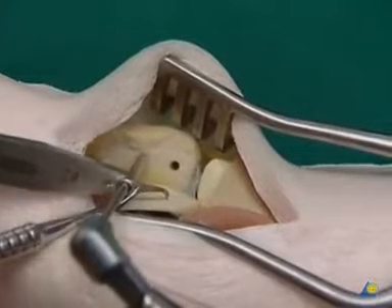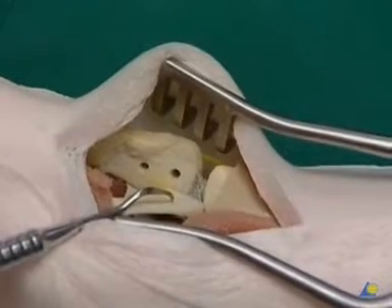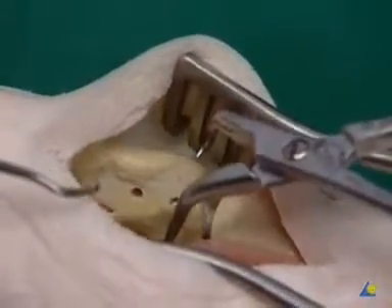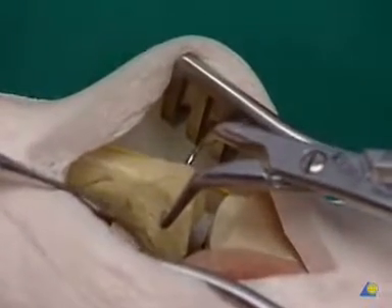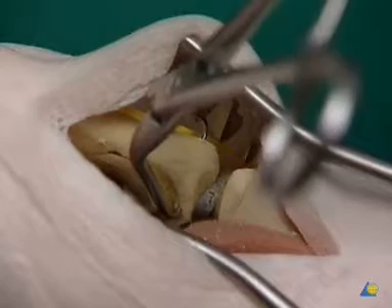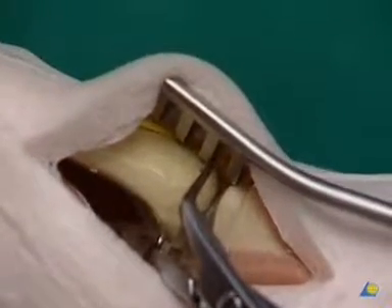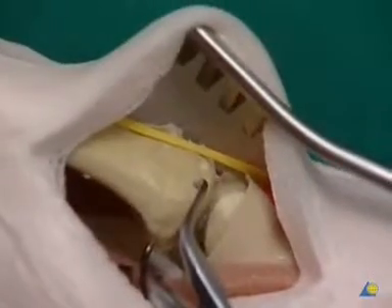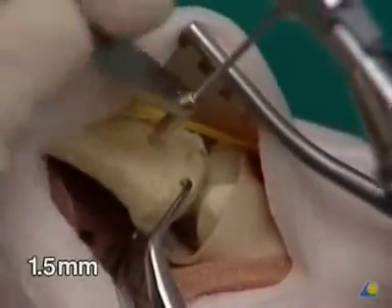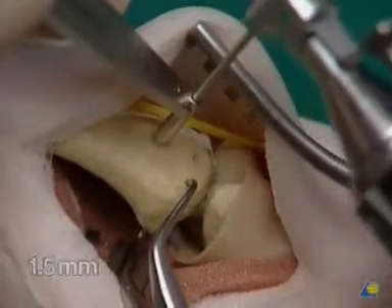The second gliding hole is drilled distal to the first one in the same manner. The Bennett's fragment can now be reduced and stabilized with the small reduction forceps. Pronation of metacarpal one will first expose the superficial branch of the radial nerve and then the dorsal exit points of both gliding holes. The 1.5 mm drill guide is inserted into the distal gliding hole and the 1.5 mm thread hole is drilled along the same axis into the Bennett's fragment.